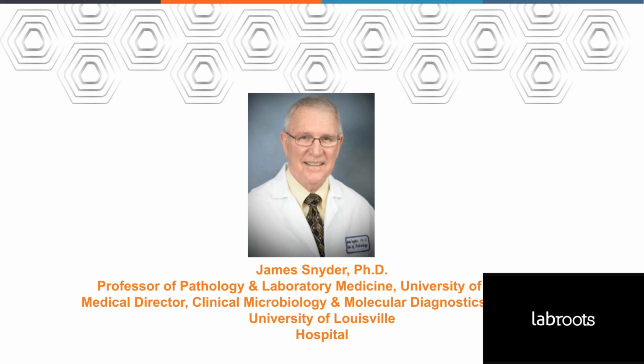And before I hand over to Dr. Snyder, I just wanted to conclude by saying that rapid diagnostics in sepsis management is critical for timely initiation of targeted therapy, and currently available culture-independent technologies are innovative and can improve time to result and ultimately patient outcomes. Blood cultures remain the gold standard for diagnosing bacterial and fungal bloodstream infections, but are limited by slow turnaround time and sensitivity.